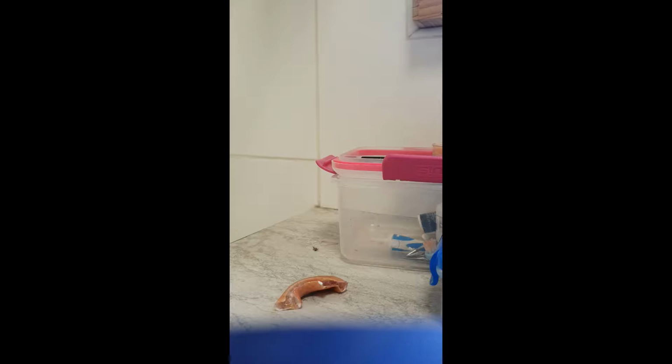Okay, continue with it. Let's have a look. It's now about 20 past. That's upside down. That's about 20 past seven. Here's the ear. You can see, if I hold it up, that glue, there's still white left, but it's mostly see-through, settled now.